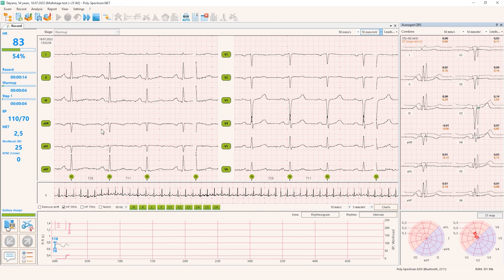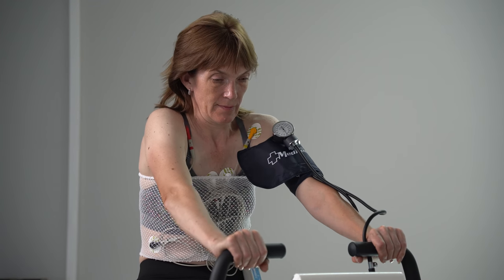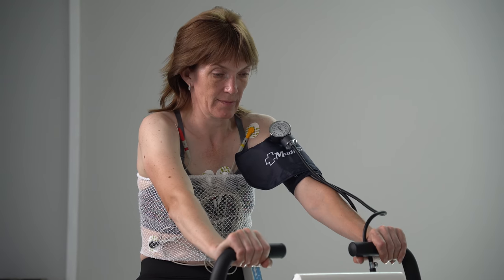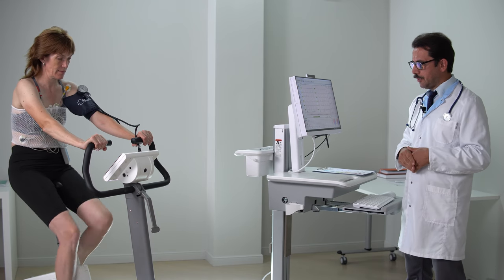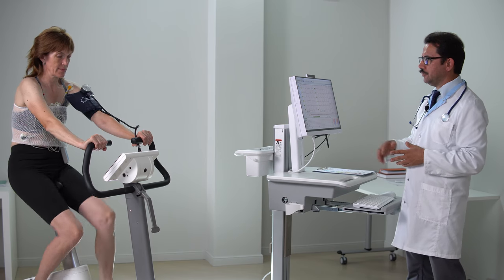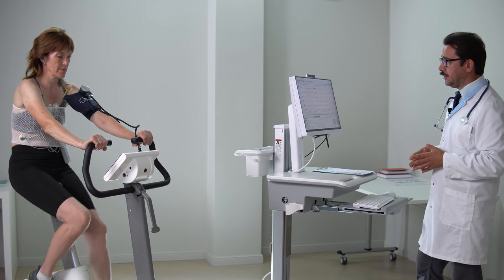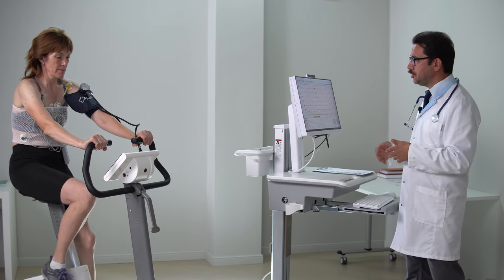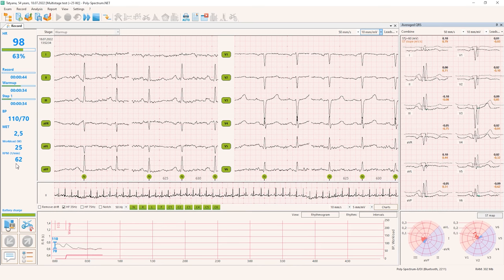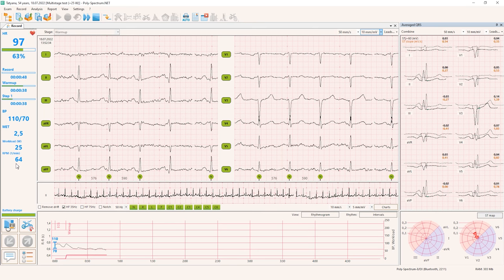Then we have the warm-up phase. Please start pedaling. The patient is checking the pedaling rate on the monitor of the bike ergometer, but here I can see the actual RPMs on the software screen. That is comfortable because I don't need to walk back and forth to check. Okay, we now have 60, 61, that's okay.